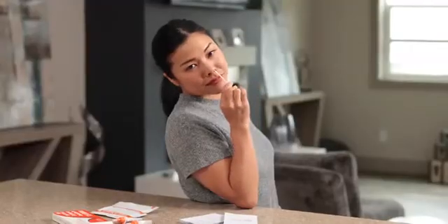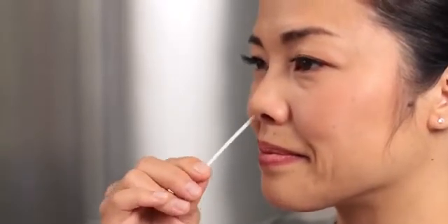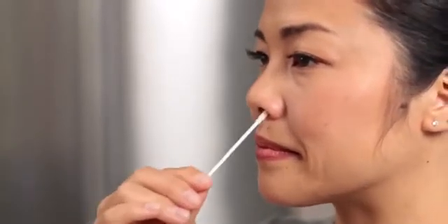But, lucky for you, the iHealth Rapid Test Swab is specially designed for simple, comfortable testing. It barely has to be inserted into the nostril, about 1/2 to 3/4 of an inch. Easy. With the swab inside your nostril in a circular motion, swab as if you were cleaning the inside of your nose. Note that this is not a matter of simply twisting the swab in place. When you've finished, swab your other nostril the same way.